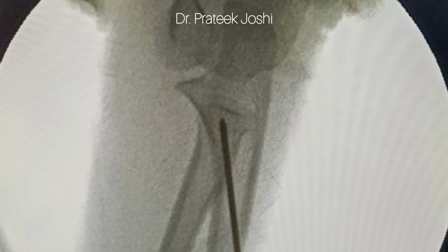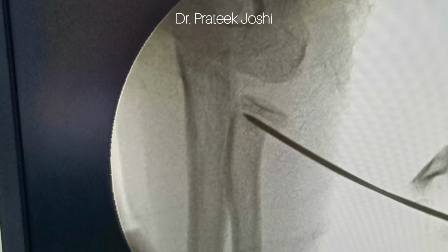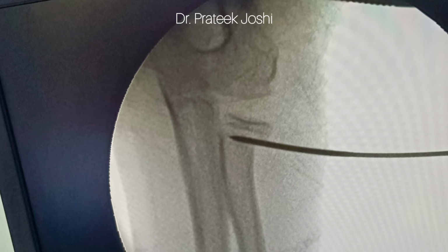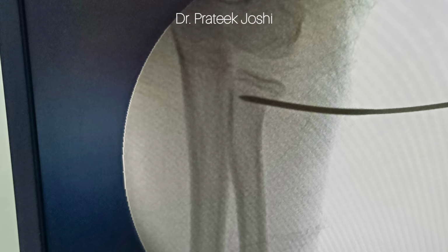So as you can see, I have introduced a K-wire from the lateral aspect right into the fracture, and once I am inside the fracture, I am going to gradually elevate the wire, which is going to reduce the displaced and angulated radial head to its anatomical location. As you can see in the sequential ITV images, the radial head is getting reduced.